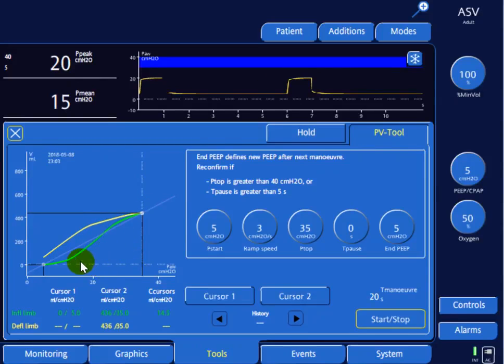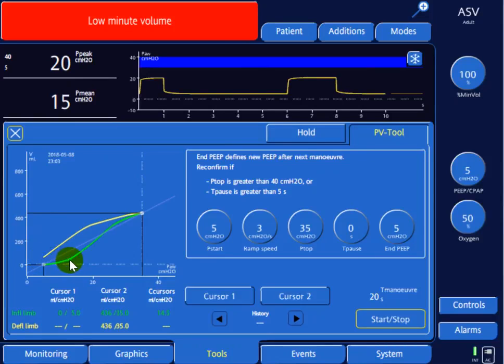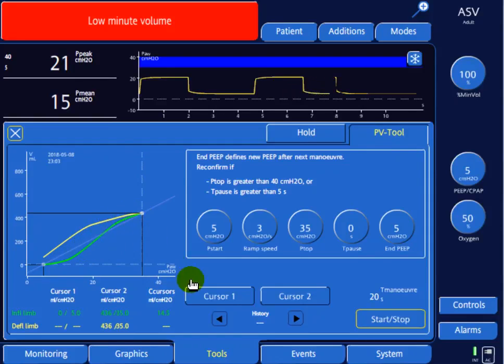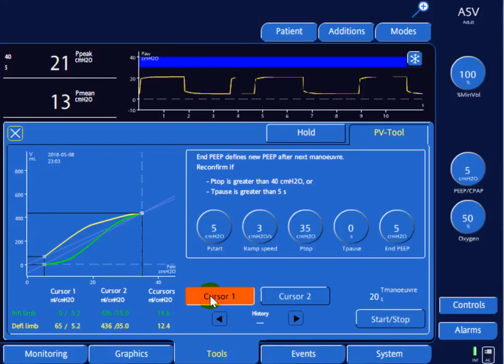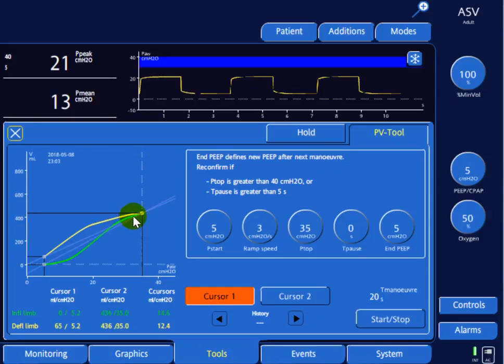This is the pressure-volume curve and we can identify three areas of different slopes. The first segment has a very shallow slope compared to the second segment, and then there is a third segment. Let's identify the segments using the cursors. The green line is the inspiratory limb of the curve and the yellow is the expiratory limb — we'll concentrate on the green inspiratory limb.